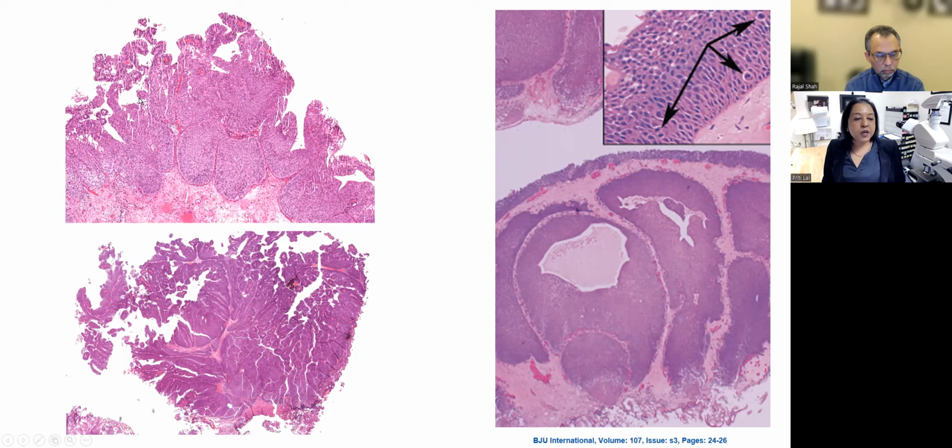However, sometimes when there is a cystoscopic resection post-treatment, this exophytic portion may be totally obliterated or removed, and you might have just a mostly endophytic lesion, or it also depends on how the lesion was cut. If this is put face down during embedding, you might just have a very prominent endophytic or inverted growth pattern.